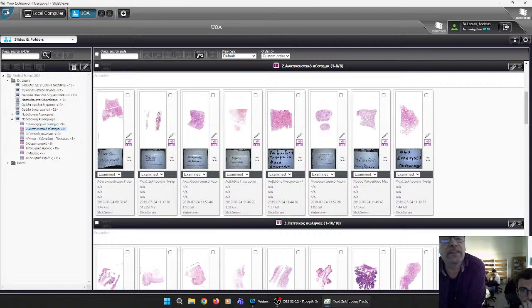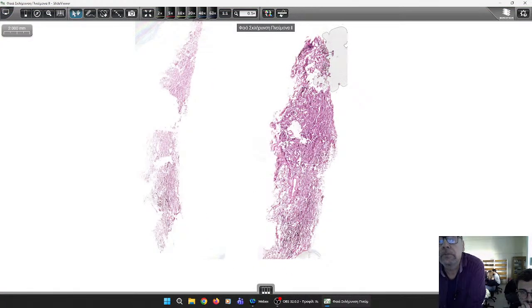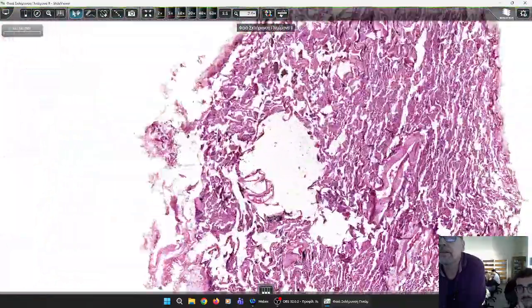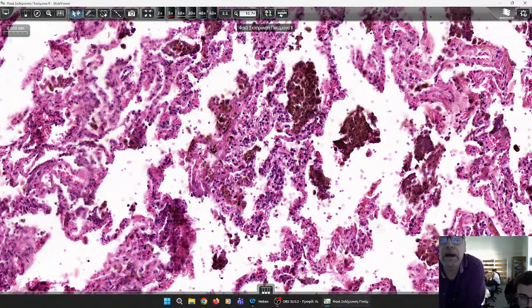But let's have a look at the other slide, this one. Now, this one, I can see some areas. Let me find the hemosiderin deposition again. It's most probably here. However, since it might be the one you saw in the macroscopic specimen, it could be carbon. You have to perform the stain. You perform Perls stain, and you identify this brown appearing pigment as hemosiderin, okay?